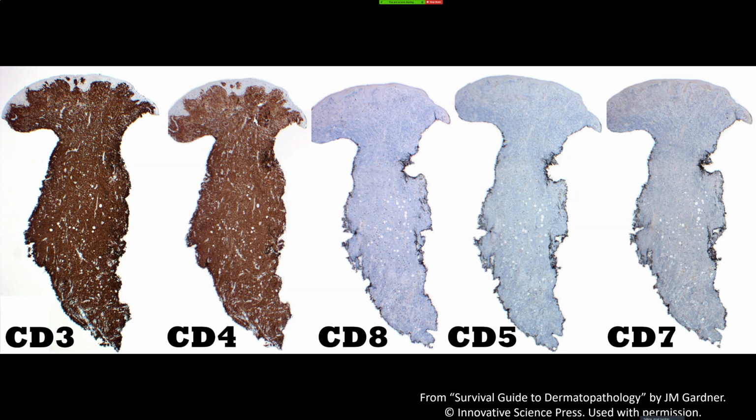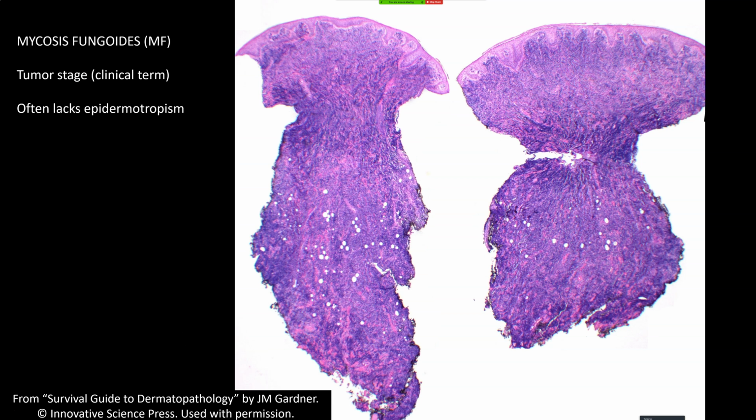But the problem is, this worked perfectly here, but I already told you on the H&E on that last slide, I know right away this is going to be lymphoma. I guess it could be leukemia or something else. But right away, if those are lymphocytes, it's lymphoma, almost certainly to my eye. Very, very rarely could a reactive thing look like that. I don't think I've ever personally seen a reactive lymphocytic process that dense.